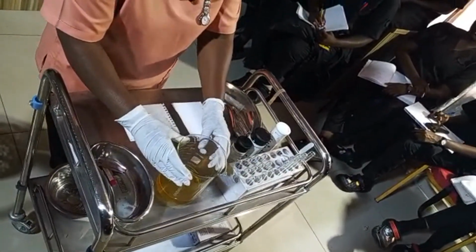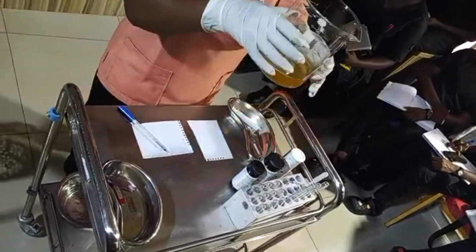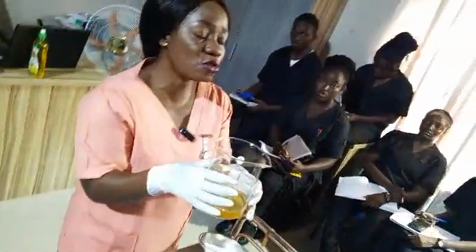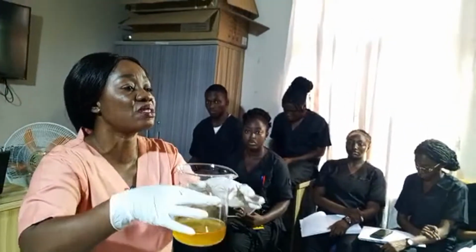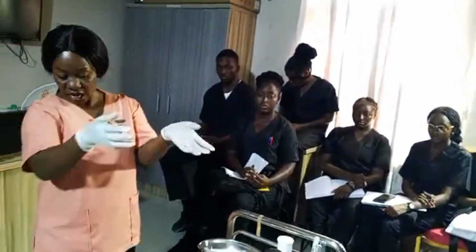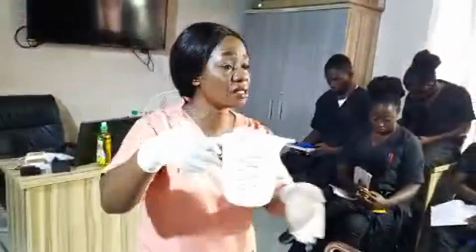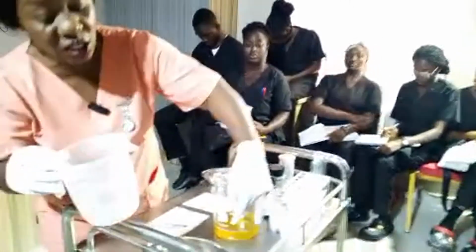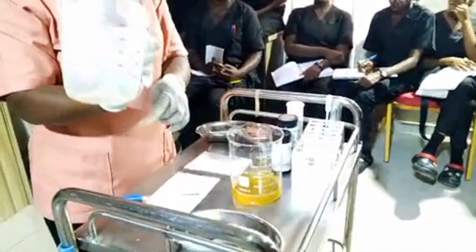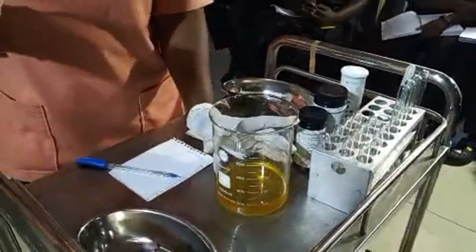So our D stands for what? You look at it at eye level. Always remember that if you are doing urine testing, the urine must be in a clear, transparent container like this. Either a beaker like this or a measuring jug like this, right? Something transparent that you can see the color, you can see the amount. A container that is graduated with numbers like this.